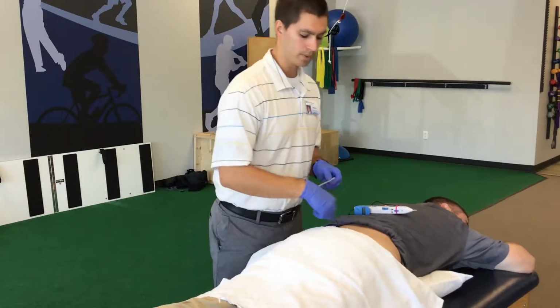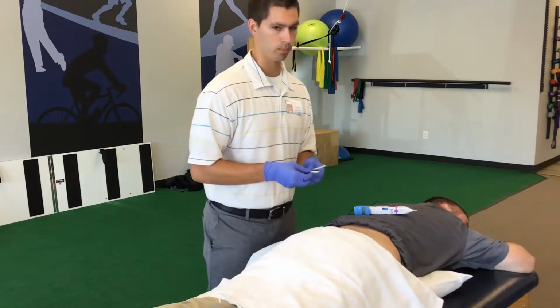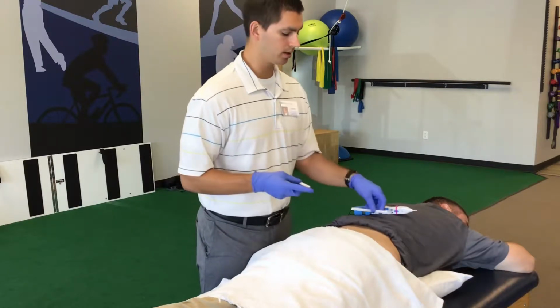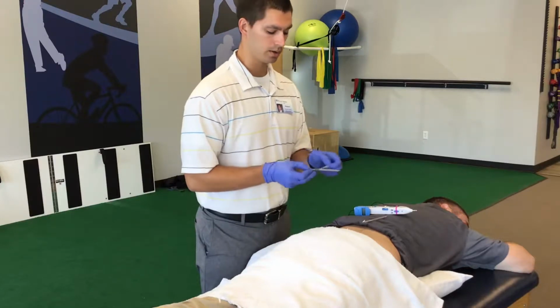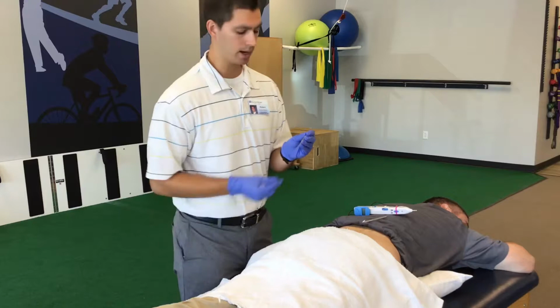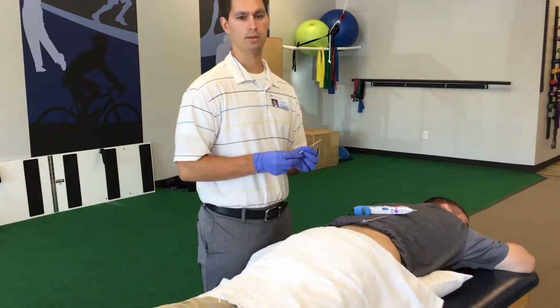So what I did is I wiped the area of his spine that we're going to do with an alcohol prep wipe. It just tries to decrease the risk of infection. The needles are obviously sterile, but the environment is not sterile. And so since we're not in a surgical suite, there's nothing that we can do. Josh has been cued. He kind of knows what to expect, but usually it's kind of a little bit of a poke as the needle enters the skin.